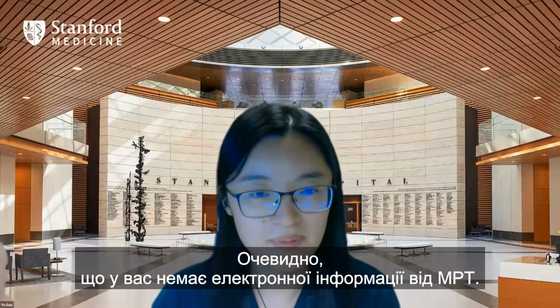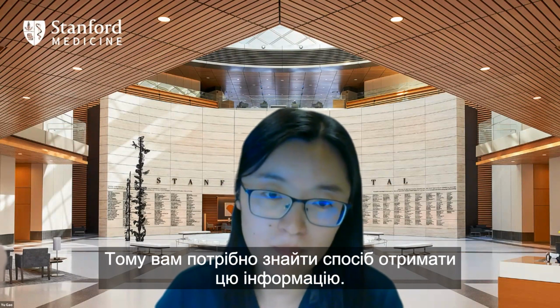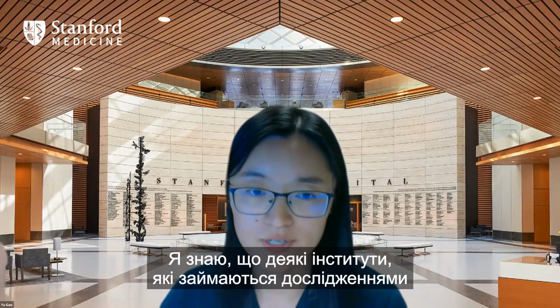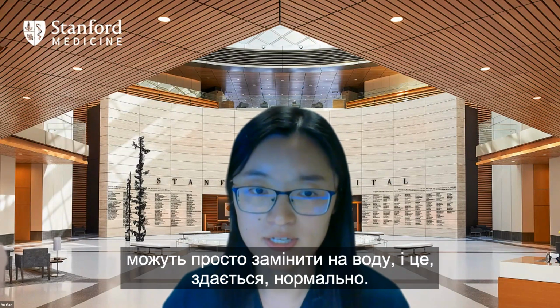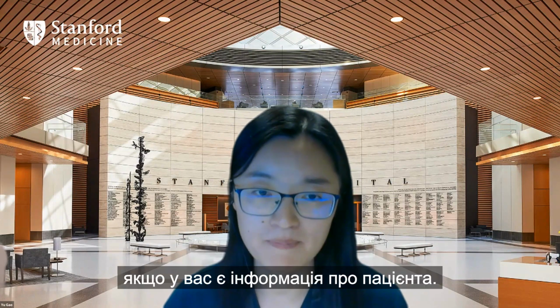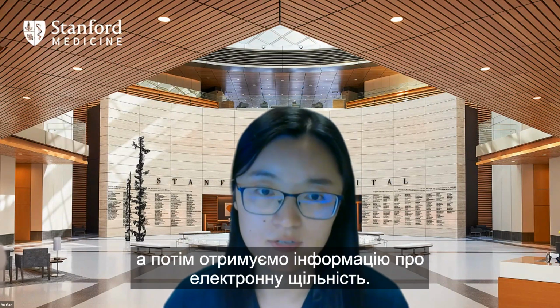That's a good question. Apparently you don't have the electron information from MR, so you need to figure out a way to get the density information. There are different ways you can do bulk density assignment. I know some institutes, for GI cases not close to bone or air, just override to water and it seems to be fine. But we feel it's definitely more accurate if you have patient-specific information, so right now we still acquire the CT image, do the fusion, and then get the electron density information.